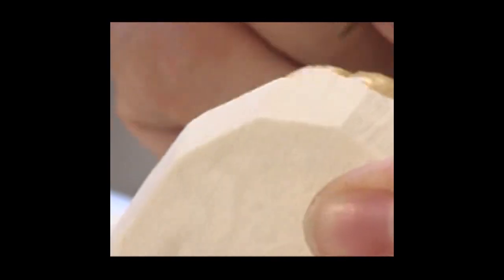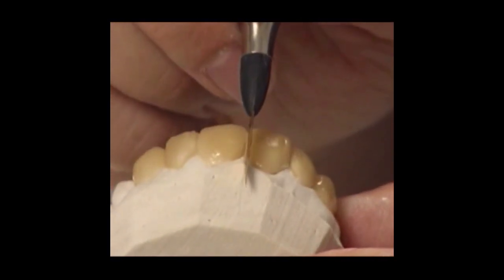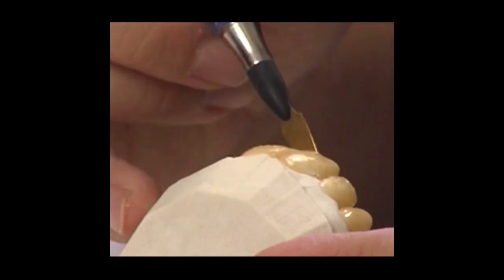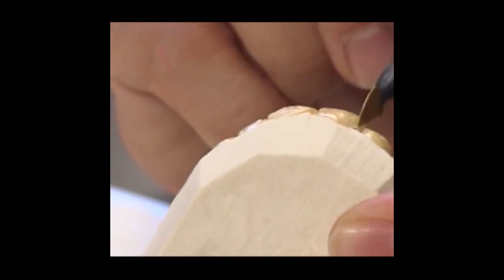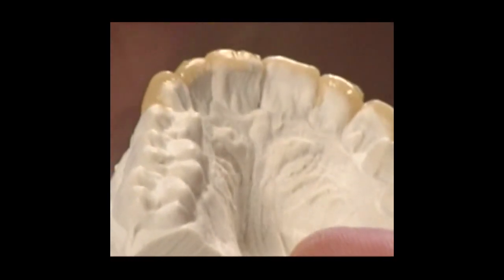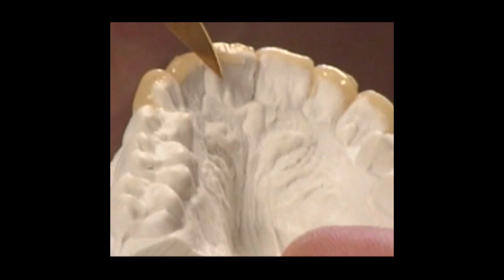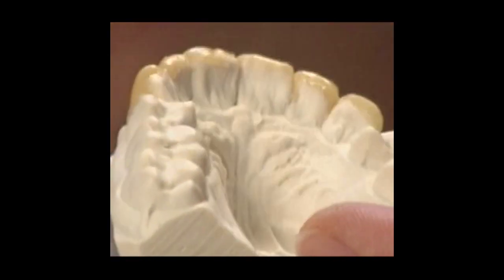Simple. Line angle is critical. Midline is very important. As you can see, they follow the pencil line that you put on at the very beginning to try to keep that composure, and do one tooth at a time so you don't lose the size and the width between the two centrals and the laterals and so on. If you look at it from the lingual point of view, you can see where the contact is. So your wax-up doesn't have to go over too much. That means you are way too much widened. So this is your reference point where the tooth was before. That's what we wanted to do.